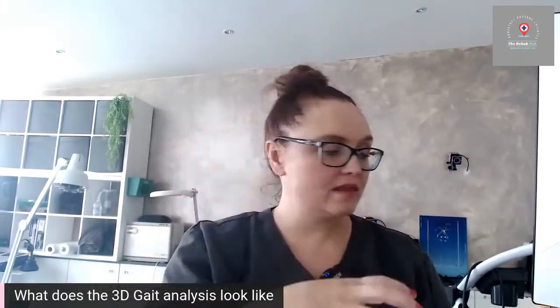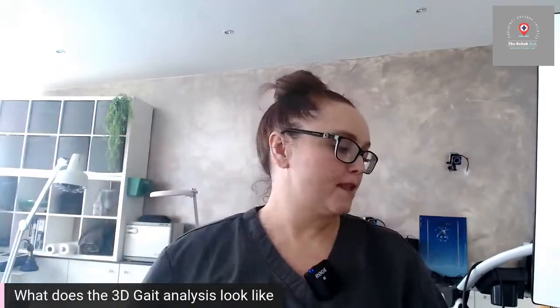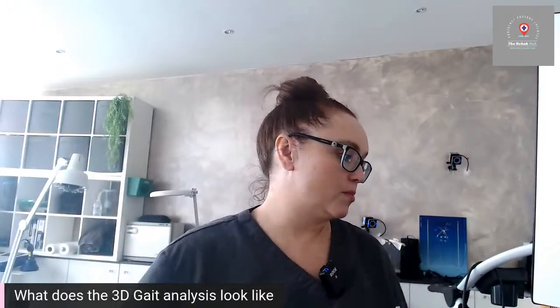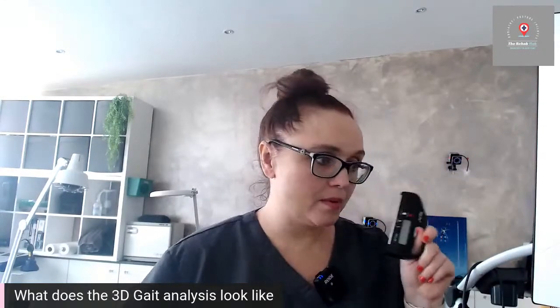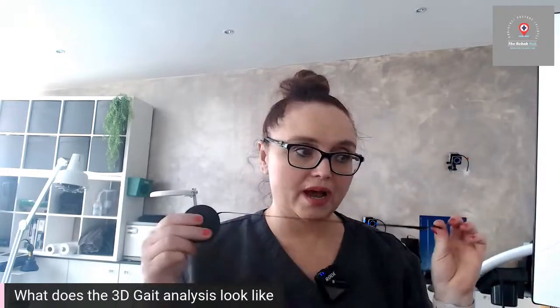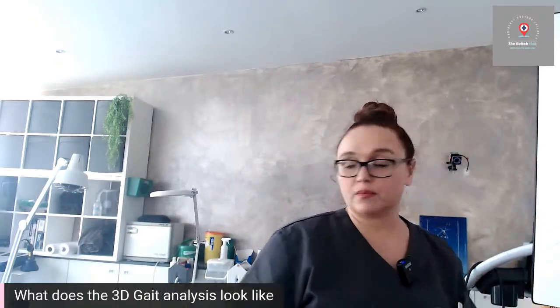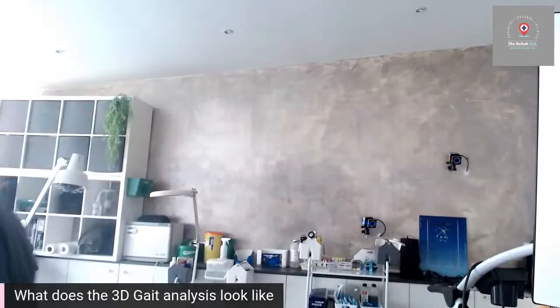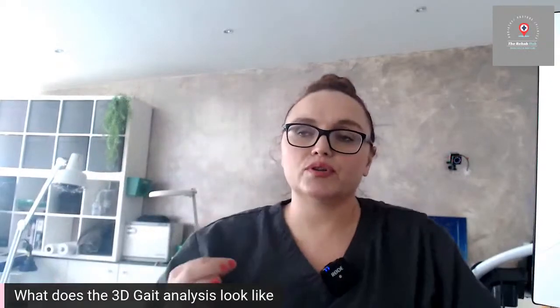And if you don't have these kinds of things, then something else has to pick up the slack. So by gathering that data, it helps us rule things out and then work out what to do about it. We also measure how flexible you are. So yep, we literally put measurements on it. We will measure your leg length discrepancy. We have all our tape measures and stuff. We will measure your strength, your flexibility, and your range of motion. So we don't just guess that, oh yeah, that feels okay. We literally put a number on it.